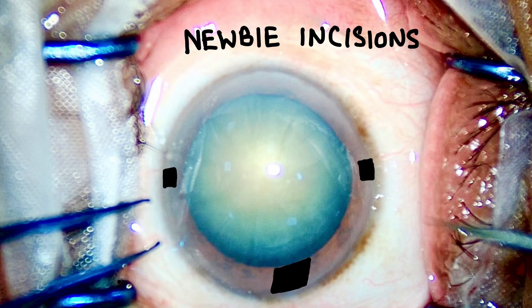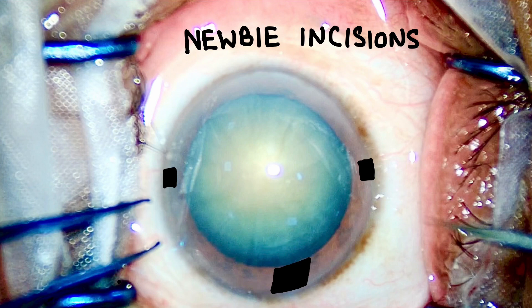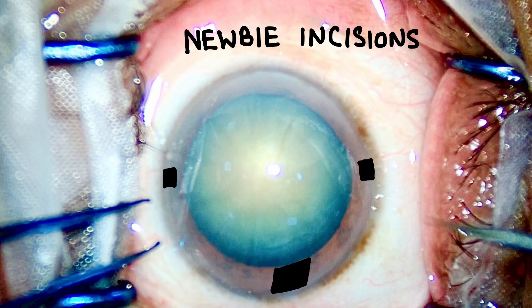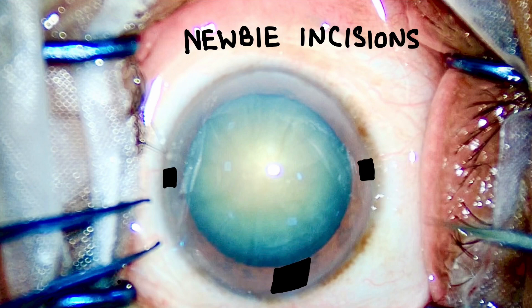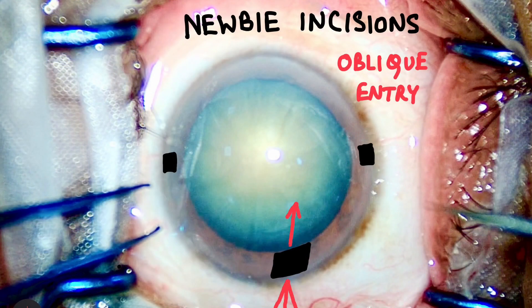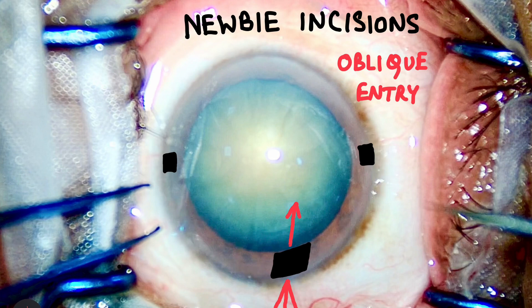The seventh mistake that a new surgeon makes is not going straight into the cornea — these are oblique incisions, poorly constructed oblique incisions that have a lot of risks attached to them. One of them is Descemet's membrane detachment. Post-operative astigmatism is very common, and anterior chamber instability due to fluidic imbalances is also a risk. Poor sealing leads to AC fluctuations which can even lead to posterior capsular rupture.